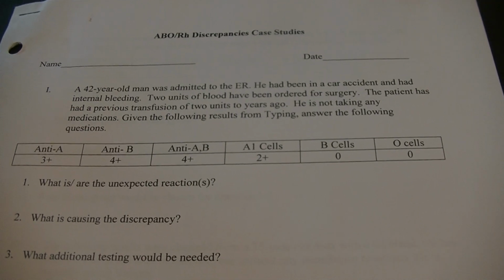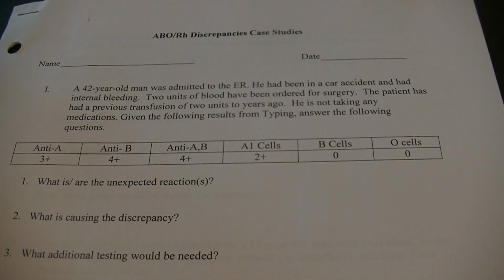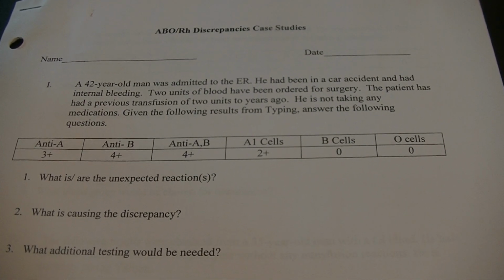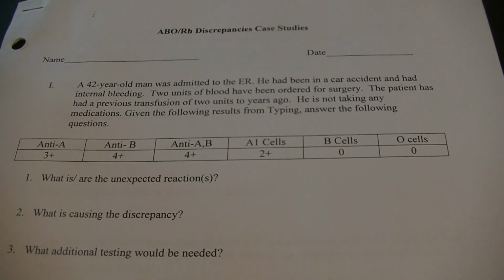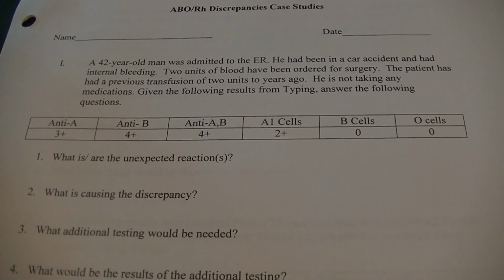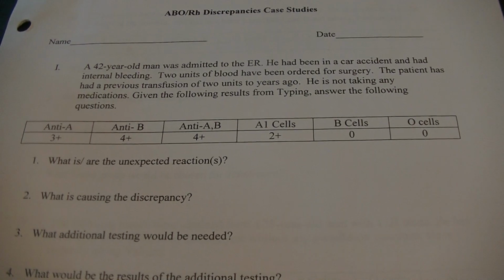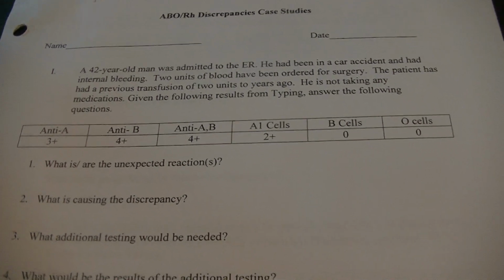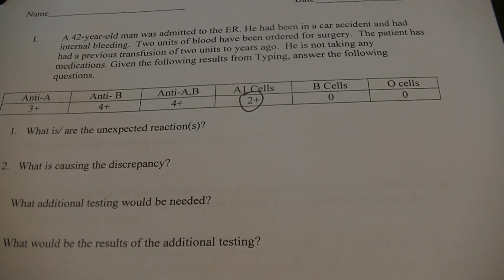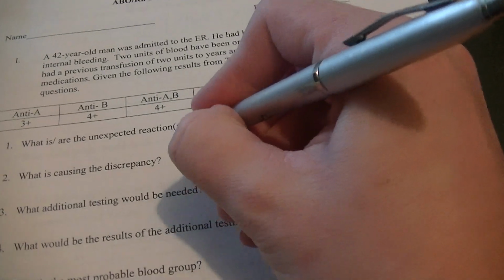By adding O cells to the reverse reaction and seeing that there is no reaction with O cells, we know that the reaction in the A1 cell tube is the reaction we should not trust, and that it is not due to any antigen reaction other than anti-A antibody reacting with A antigen. So we do not trust this reaction, the weakest reaction. So the unexpected reaction is with the A1 cells.